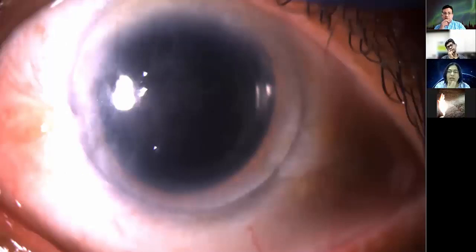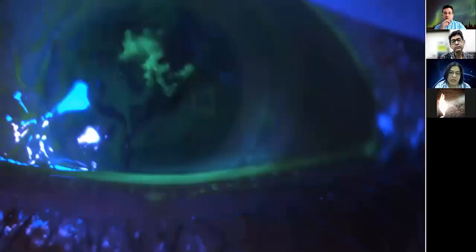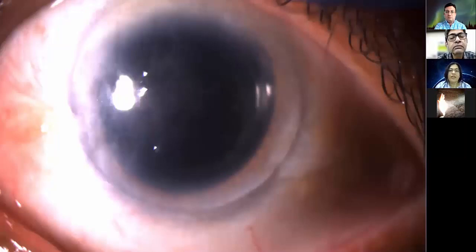More or less okay looking cornea, AC looks quiet, IOL is in place. There's some sort of a haze on the cornea, but probably something he already had. When you look closer, you see, okay, there's some pattern forming here. Probably better to stain it and see. When you stain, you realize there's a dragon sitting on the cornea, and obviously his vision has dropped to 6/60. And there's the reason why. Here we had the benefit of having seen him before and treated him for viral keratitis. So it was really high on my suspicion list to begin with. But these are the cases where the cornea will fool you. When it comes like this and it actually is this, it's difficult for us to know unless you have the right filter on, so to say.